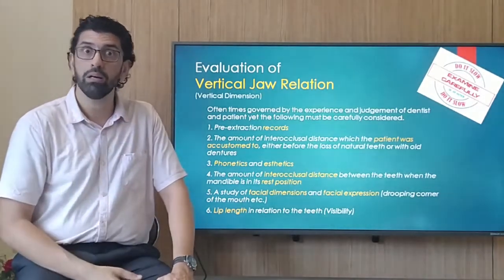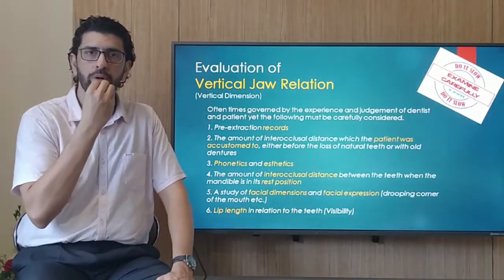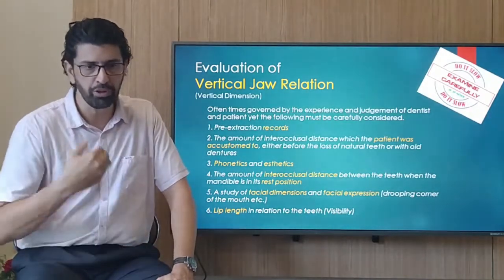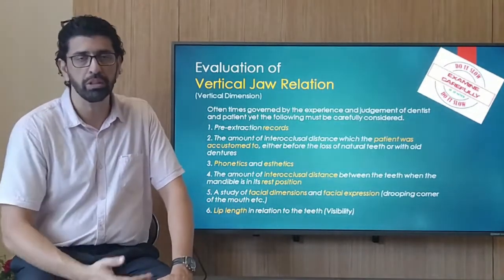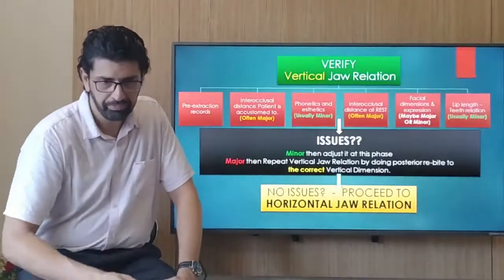The patient is struggling to close the mouth, or he opens the mouth a little bit. Normal speaking, you can see a lot of teeth. So the lip length relationship with the tooth, that is the visibility aspect. All these things you can check at this stage.